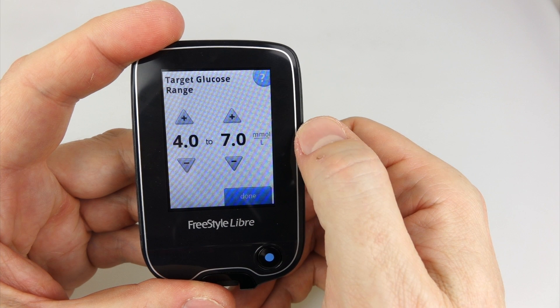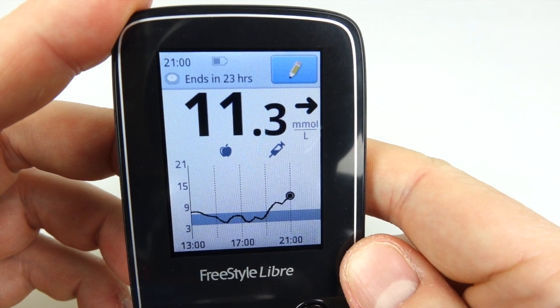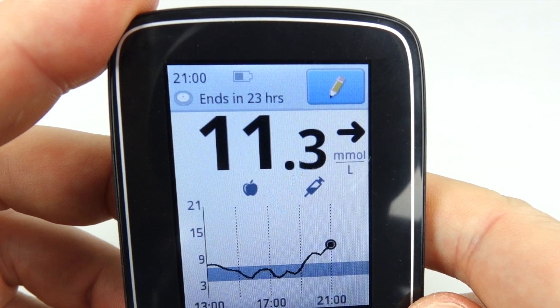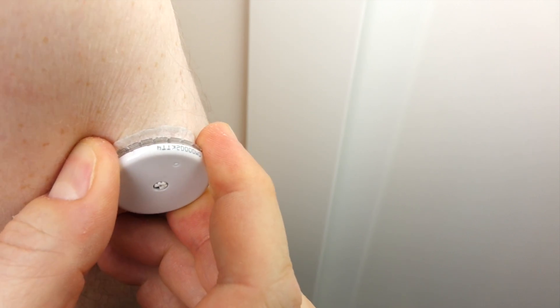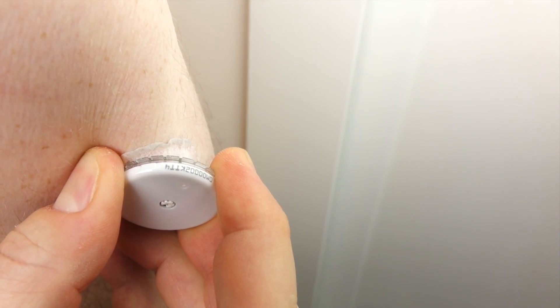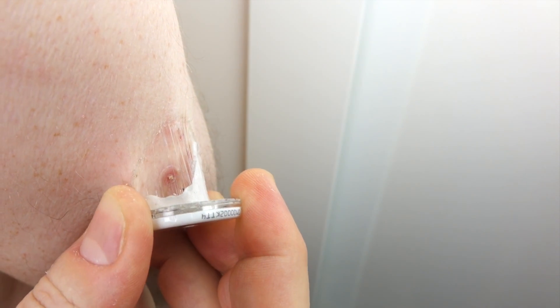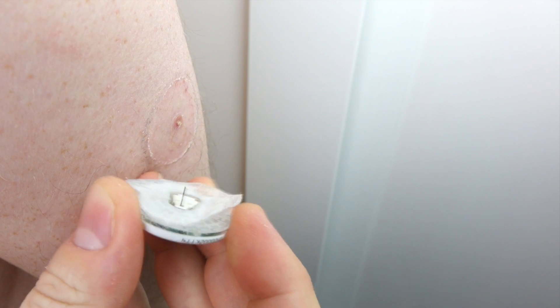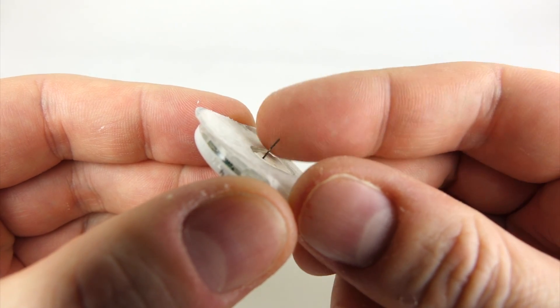You've also got the option to put your own target range in — mine's set at four to seven. You can only wear a sensor for 14 days, at which point it stops giving readings; it tells you when it's going to run out and gives flash-up warnings as it gets close. Here's how you remove one — you just pull it off your arm. I didn't feel anything at all. It doesn't look nice underneath but one wash to get rid of all the sticky stuff and a little bit of scar tissue in the middle, and we're back to normal.